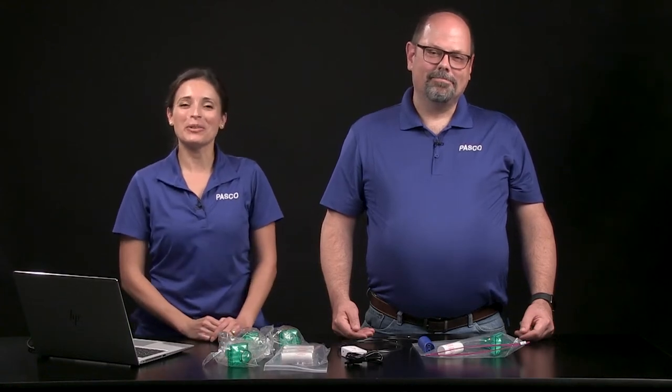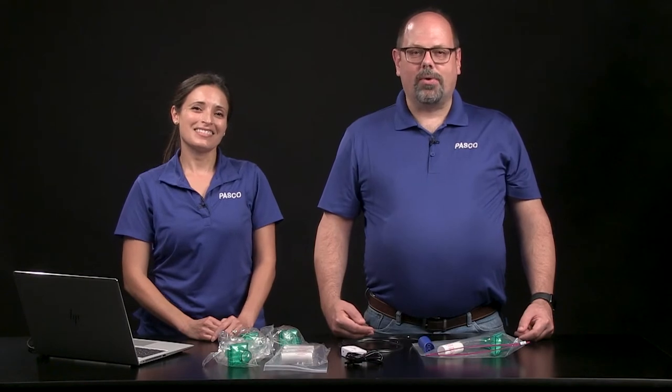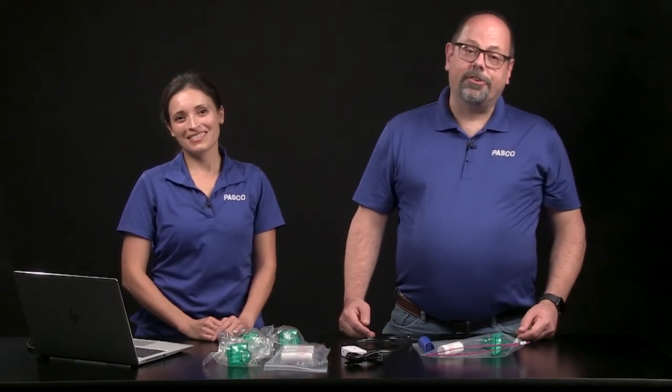What can volume data tell you about your lungs? In this video, we're going to look at how PASCO's Wireless Spirometer helps students learn about lung function.